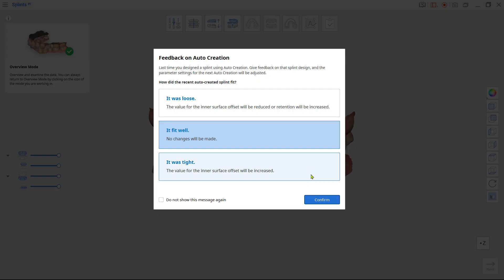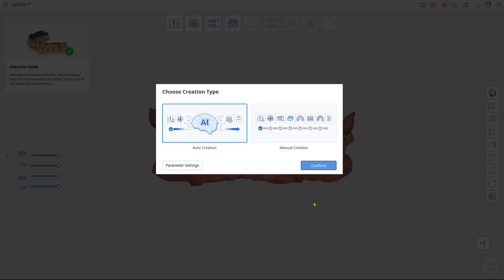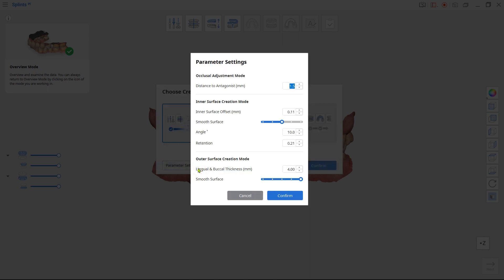If your last splint was designed by using auto creation, you would be asked how the printed splint fit was. Based on your selection, the AI will adjust parameter values for the next auto created splint. Parameter values can also be set manually prior to choosing auto creation in the parameter settings.